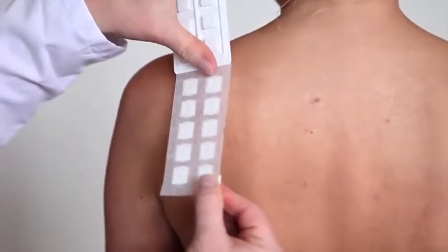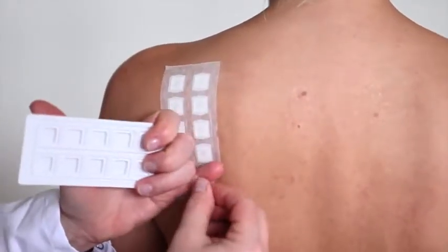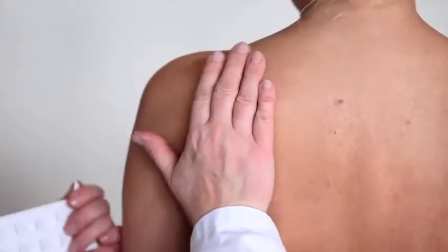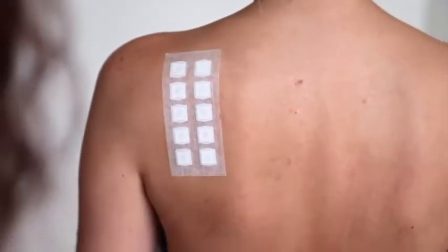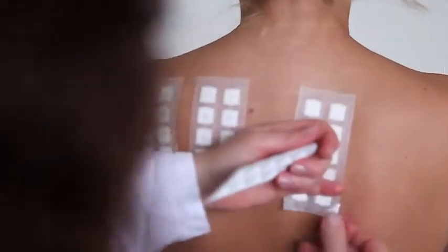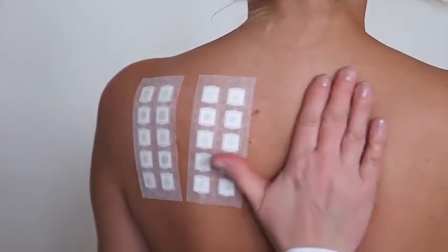When applying the test patches on the patient, use if possible the upper part of the patient's back and avoid applying patches to the midline and the scapula. Apply the IQ unit gently and remove the corner. Press the tape with the palm of your hand for a few seconds. The pressure and heat will enhance adhesion.